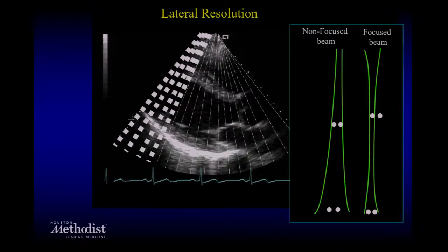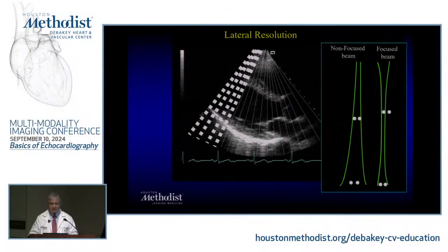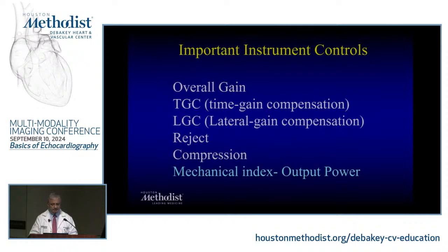And the higher the frequency, the better your resolution. But there is also a trade-off. If you have a high frequency, you may not be able to penetrate as much. So a lower frequency transducer in somebody who's difficult to image may have better penetration. Nowadays on the machines, you see high penetration, high resolution. That's behind what you're thinking. Basically, they're changing what frequency you're sending.